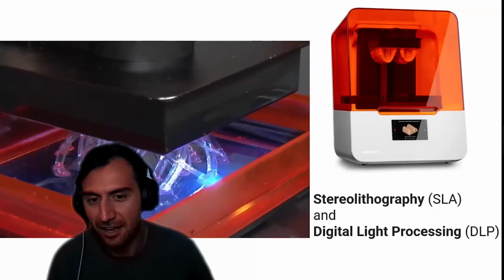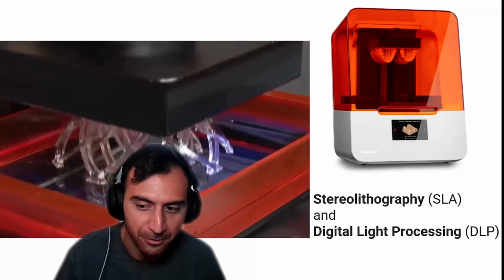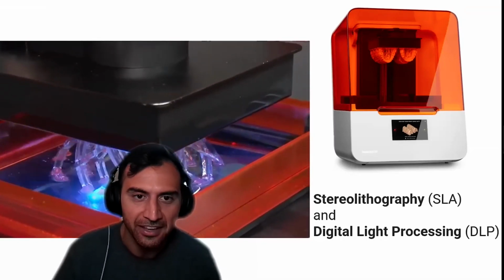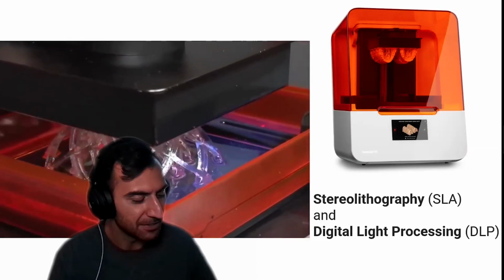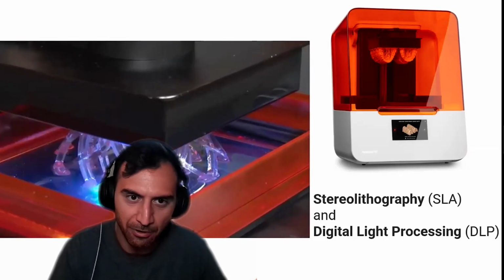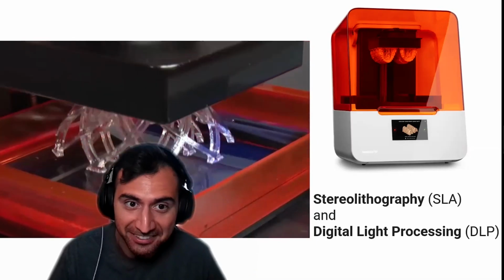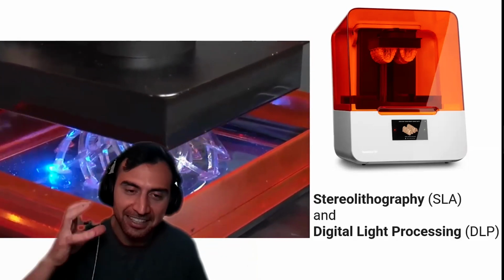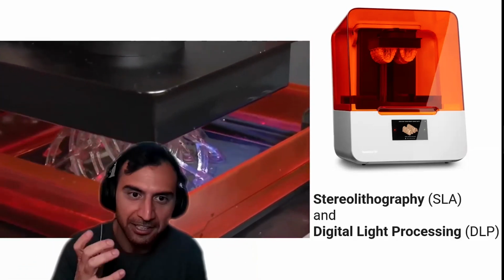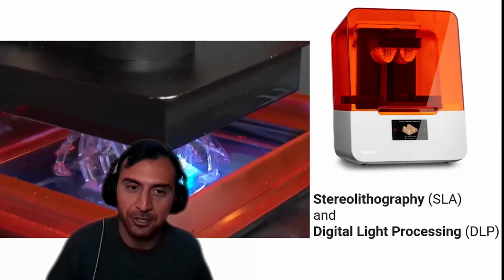Then came what we call SLA or DLP, stereolithography or digital light processing printers. There are variations of them now, but basically, there is a pool of resin. A light shoots at the resin and cures it. Sound like something you know? That's right. Yep, resins, dentistry, right? It's up our alley. Basically, it's a liquid resin. You cure it, it polymerizes, and you've got hard resin. So we use that stuff in dentistry all the time.